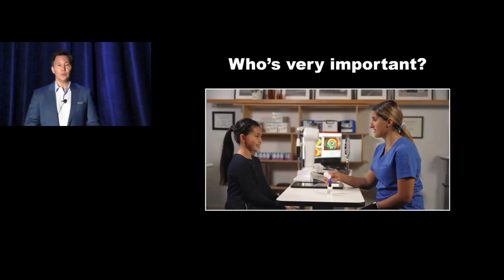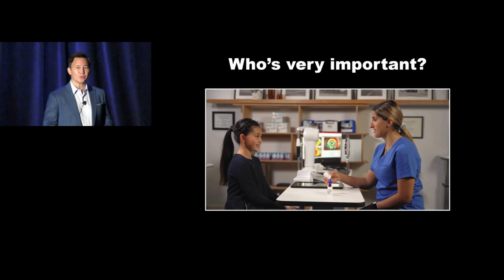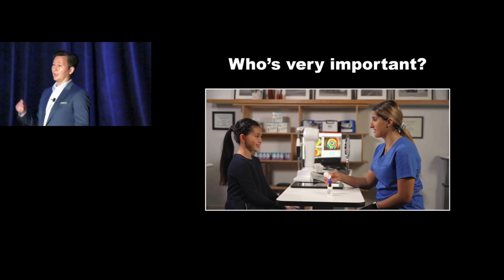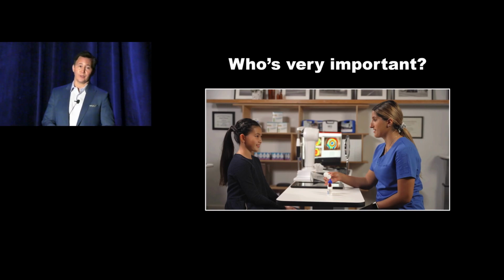Okay, so who is the most important person in your practice related to ortho-k? Is it you? Is it the technician? I would argue that it's the person taking the topographies, whoever that is, be it your technician or you, but the most important person is the one in charge of doing that capture of each one of those maps.